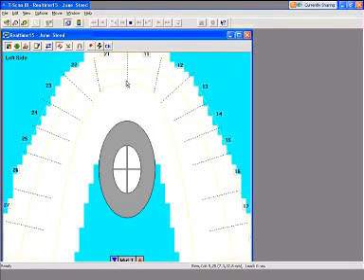The instructions that I give the patient for the lateral excursive movements would be bite down hard and hold and slide your teeth all the way to the right and open. Then I would stop the movie, start a new one. I can do all of this right from the handle. So obviously, I'm my own patient right now. I won't be able to speak to you, but I'm going to do 3 movies in a row, and the purpose is to show you how quickly you can gather the data, and it's not going to encompass too much of your time.